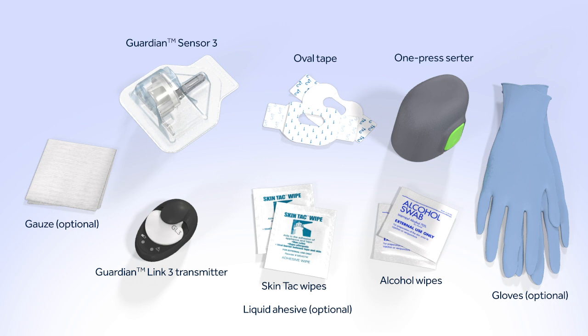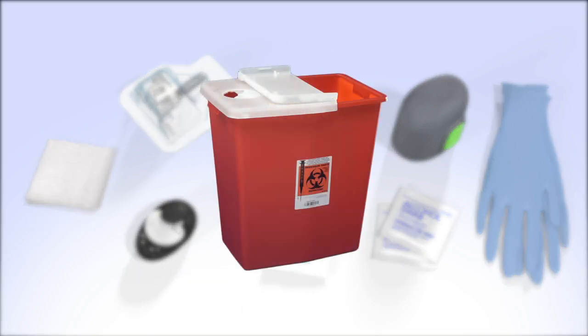Gather the following supplies: a Guardian Sensor 3, the one-press serter, oval tape, a transmitter that has been fully charged, an alcohol wipe, an optional liquid adhesive, any other optional off-the-shelf adhesive you plan to use, and a sharps container.